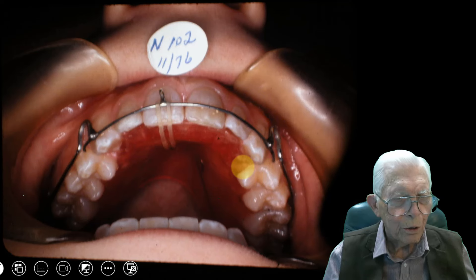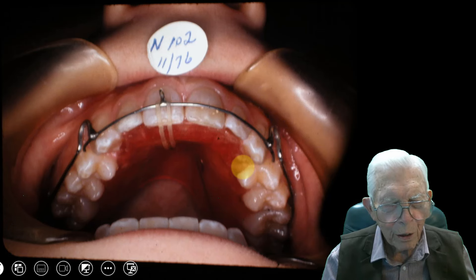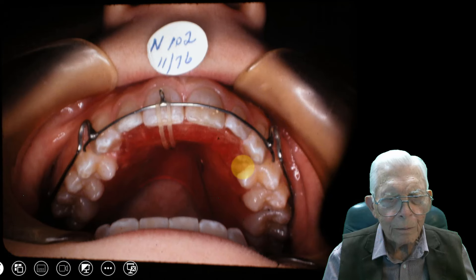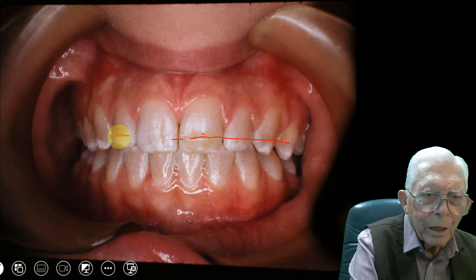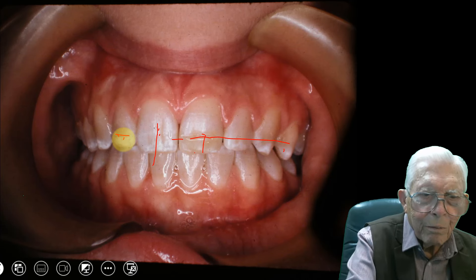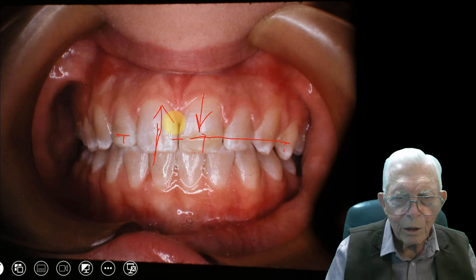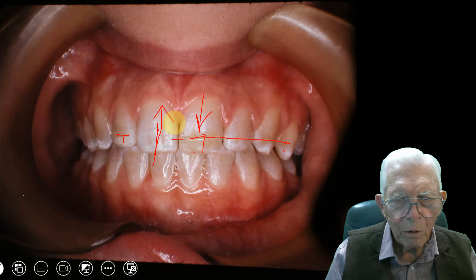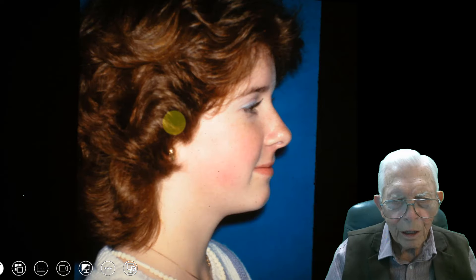These are different ways to handle teeth that move out of position after you finish a case. You could do this, or if you had a method of making one tray, you could put it in place that way. We hooked this wire in on this and this — when it pushed this up, it was pulling these teeth down, so you get the same force going. This tooth was coming down, and we raised it in place. That's how we finished some of the cases out, because a little thing like that comes out — and here the young lady is with the thing lined up again.